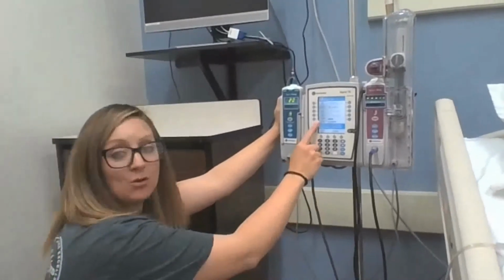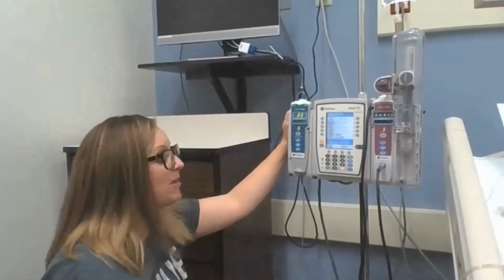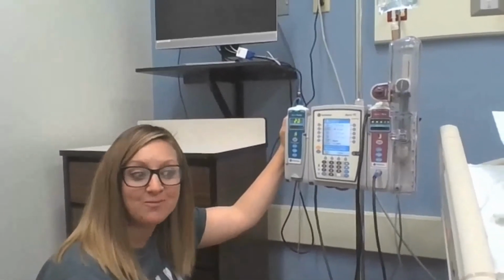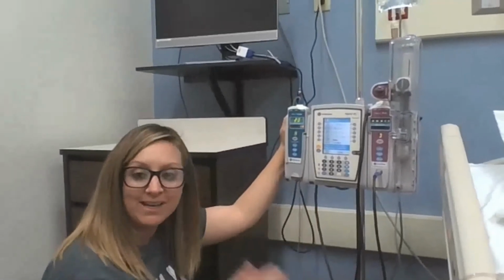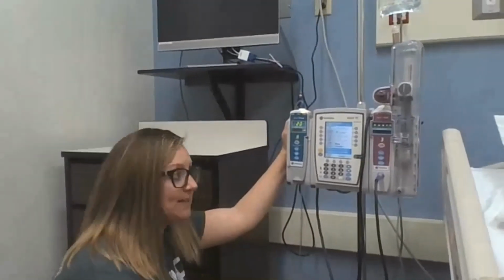Then it's asking for a loading dose. It's only going to ask me this the very first time that I go to program the pump. A loading dose is basically an initial dose. So if my patient just got out of surgery, I want to go ahead and kick them off. I'm going to give them a boost, and then they're going to have their regular dose infusing.